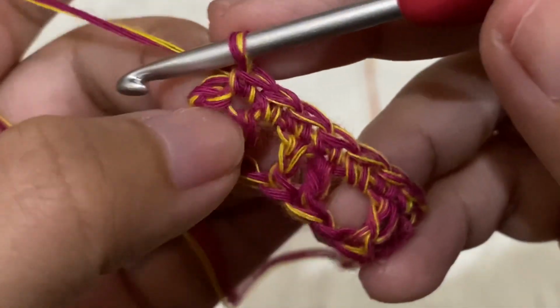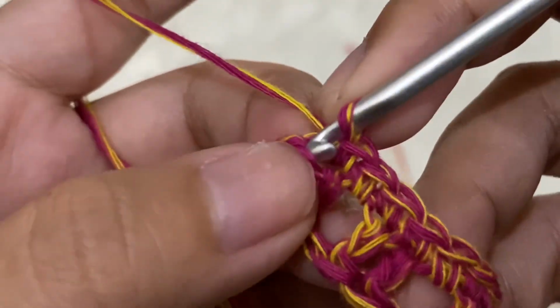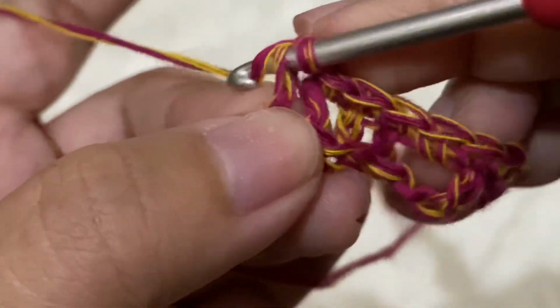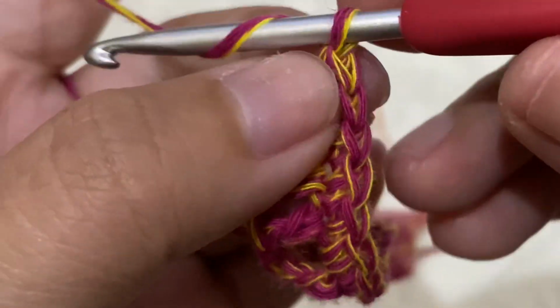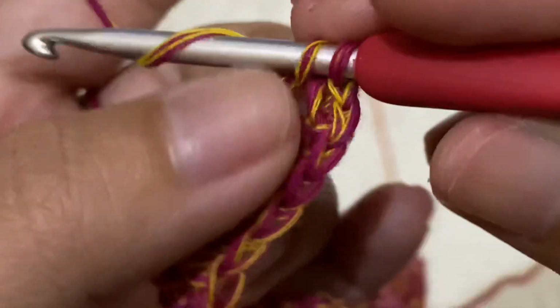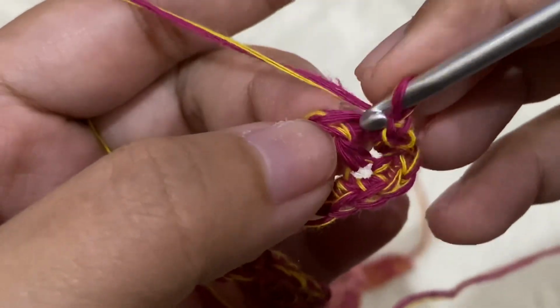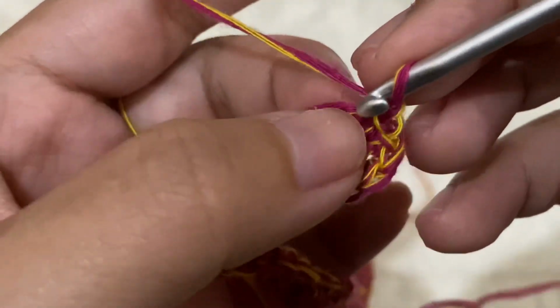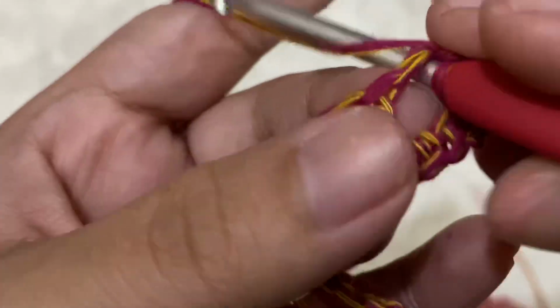So we're at the corner right here at the end, so I will just make a single crochet on that chain. Okay, so that's actually the 3 chains right there that works as a double crochet at the beginning, and then chain 1. Again, this part doesn't matter what you do, just make sure that you reach the other side. So what I did is make 2 single crochets around that chain that works as a double crochet, and then keep on doing single crochet until I reach the other side.